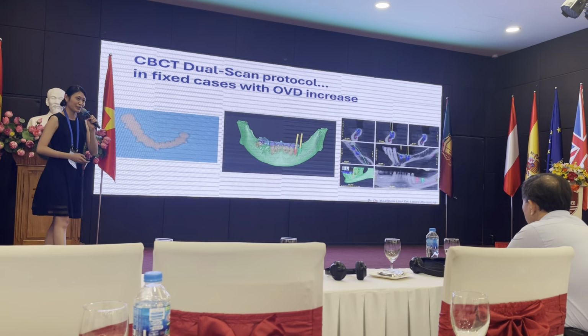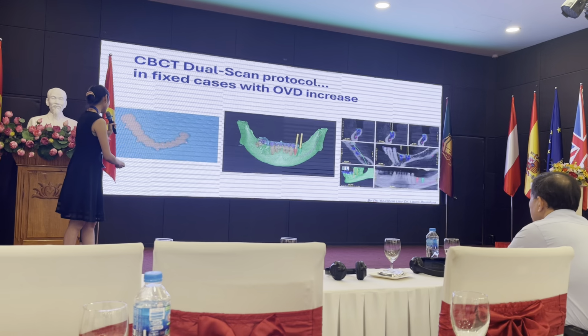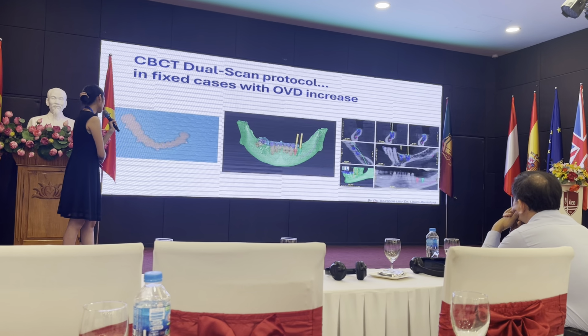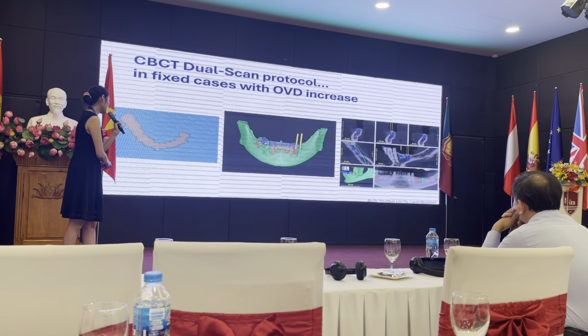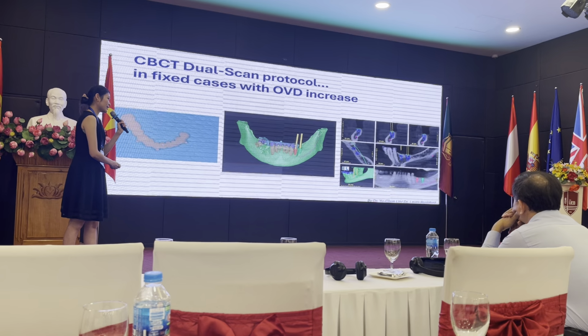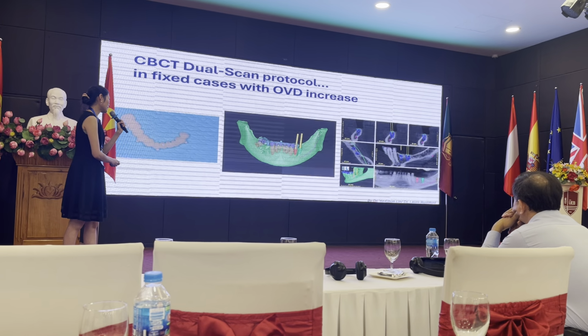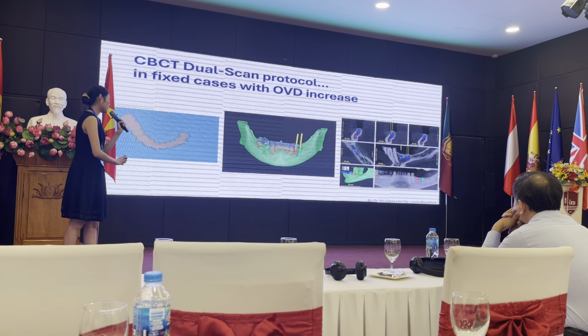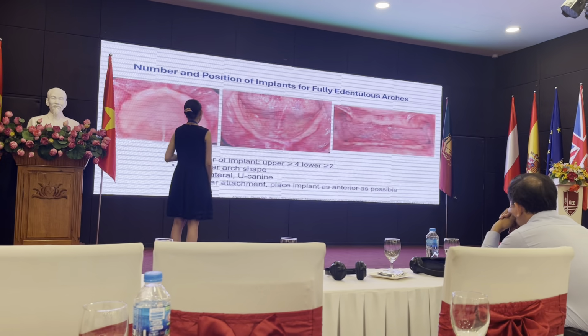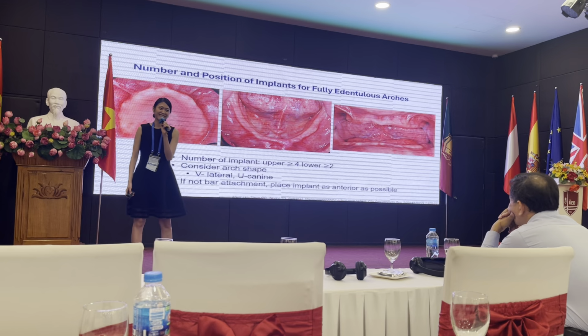And then what we can do next is, I think this is really incredible. We can put the visual markers on the provisional tube, and then you can scan this together, and you will merge it into your CBCT, so you get the ideal implant position, and you know how much space that you have.